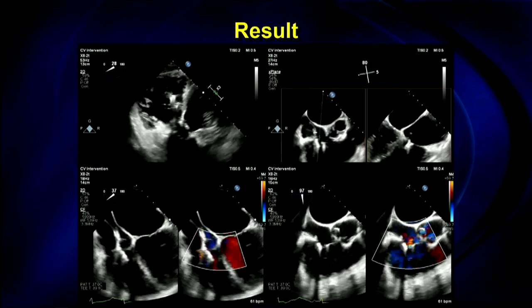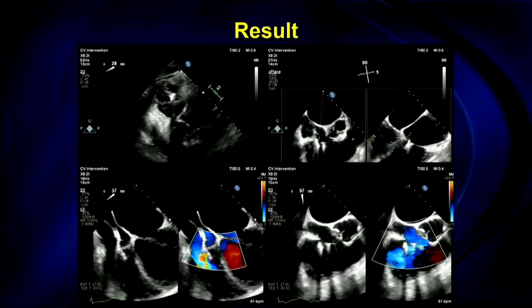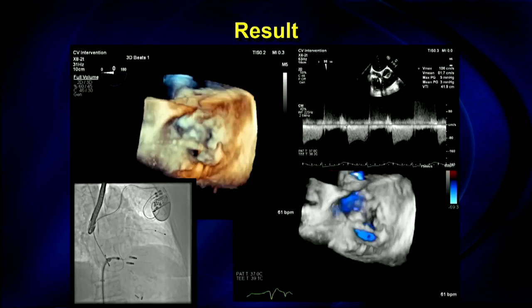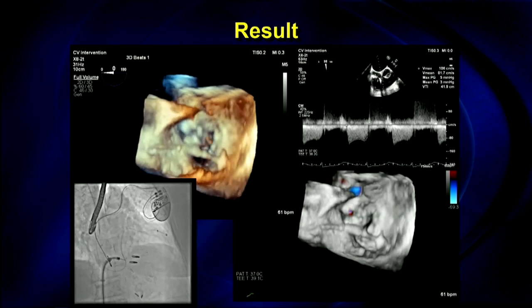So it gives you a lot of confidence, a lot of detail as to where to go and how your clip arms are aligned. And here, again, we have a nice result. In that same patient, on the 3D, you can see the two clips, just not with the same spatial resolution. And I really think that transgastric short axis view is key for tricuspid clipping, and it's something you need to practice. So here we had a mean gradient of 3, nice clip arm alignment, parallel to each other.